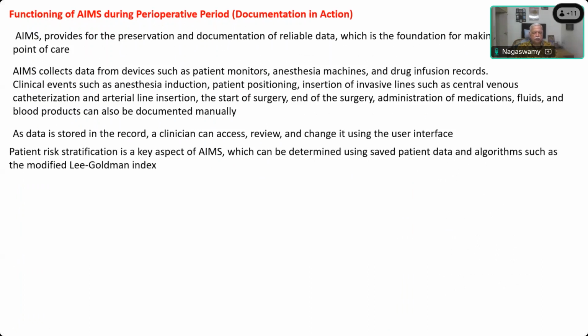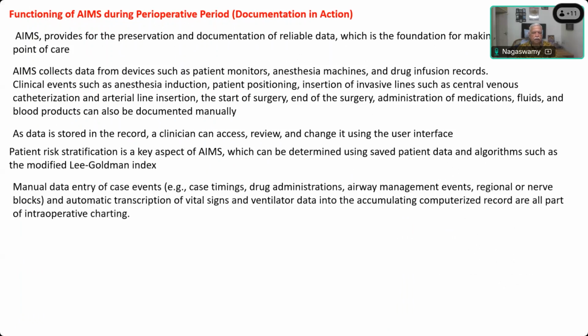Similar to that, there is a Lee Goldman index. By going through all the preoperative stored data, you can write in the case sheet documentation itself what is the risk involved in that particular patient undergoing a particular type of surgery. Then manual data entry of case events like case timings, drug administration, airway management events, regional or nerve blocks, and automatic transcription of vital signs and ventilator data are all now part of computerized intraoperative charting.